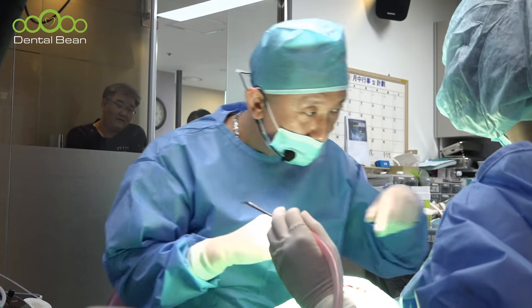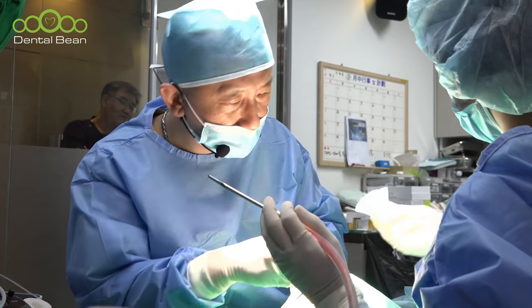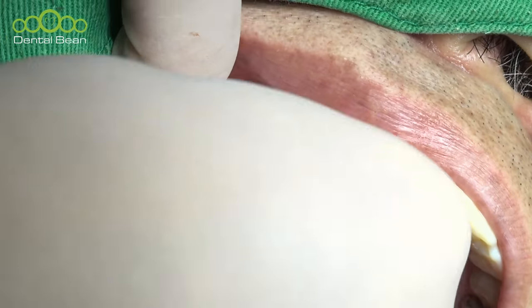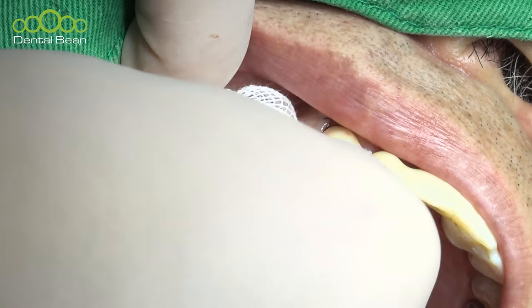Usually after surgery, gauze please. I observe. Some pressure is good, press. Dead space remover for stable healing.